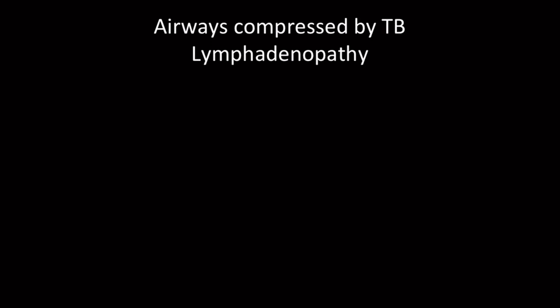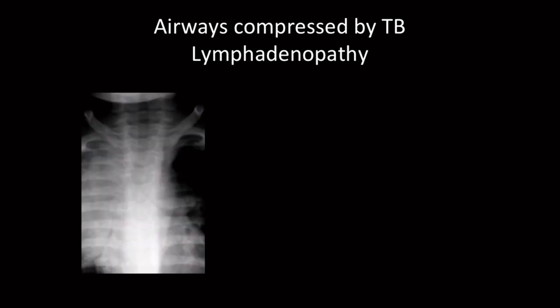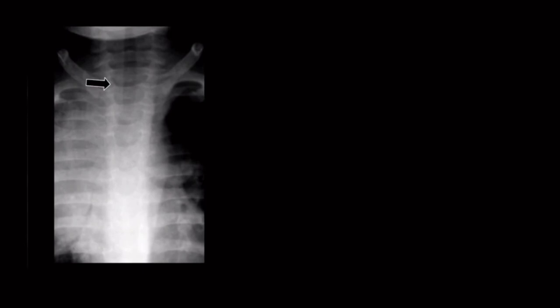So let's look at some airways on chest x-ray that are compressed. I've zoomed in so that you can see the displaced trachea. In a child, the trachea should be to the right because the aortic arch is on the left — if you see the trachea pushed over in a child that's not rotated, then you should worry. And there's a compressed bronchus intermedius and a compressed left main bronchus. I don't need to see the lymph nodes, and as you can see I'd have a lot of trouble in this case because of the airspace disease or pneumonia going on around it.